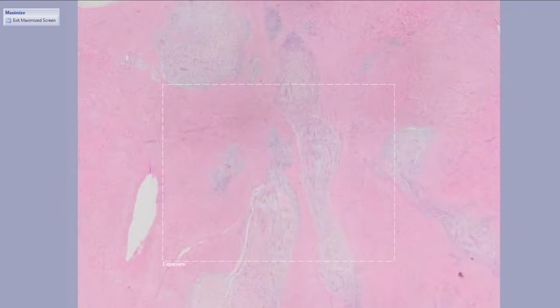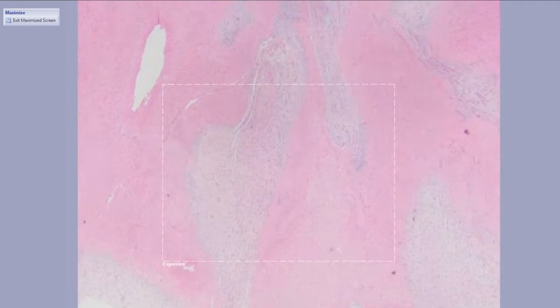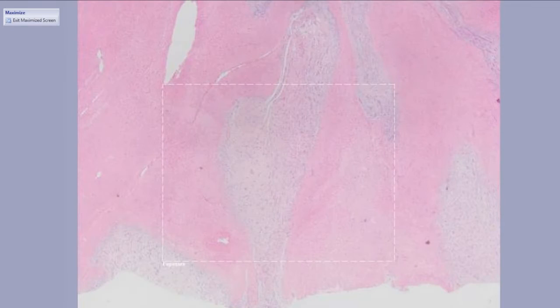Almost done on the stomach. I've got two more stomach masses here, and these are both rare and sufficiently rare that these slides are both gifts to me. But this is a stomach mass that looks plexiform. You remember maybe a little bit like that pediatric type GIST, although this is very, very discrete. There's relatively speaking a mile between each of these little tendrils.